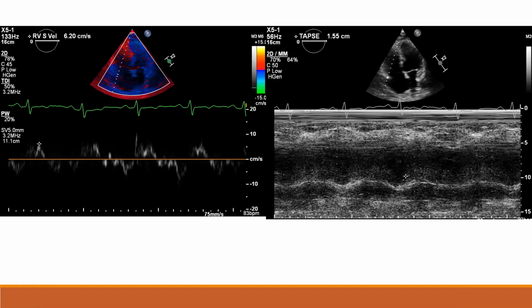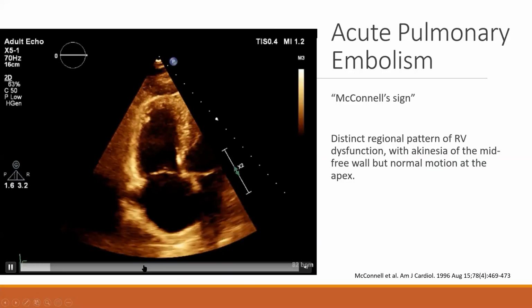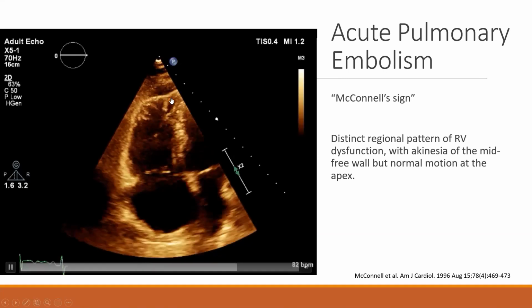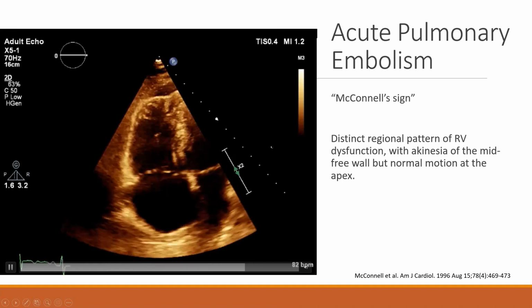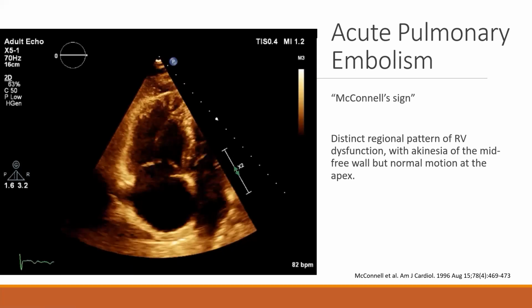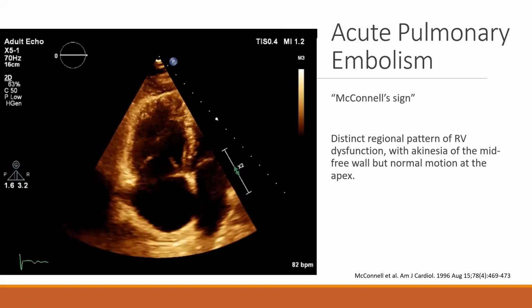And then here's our tissue Doppler and our TAPSE. The S prime is reduced, suggesting right ventricular systolic dysfunction. And the TAPSE is also reduced, suggesting the same thing. So this patient has a dilated right ventricle, reduced systolic function, but interestingly the apex appears to be preserved. And this is a distinct pattern known as McConnell's sign in the setting of an acute pulmonary embolism.